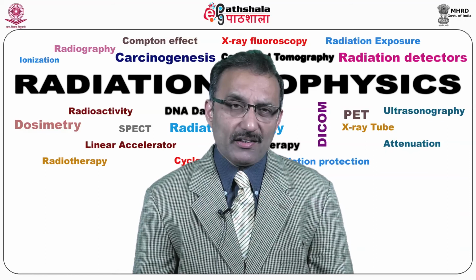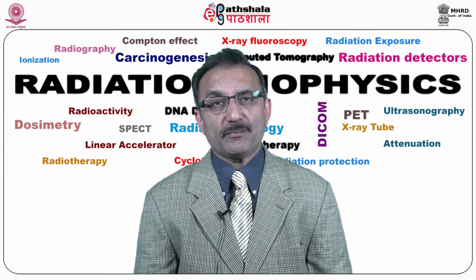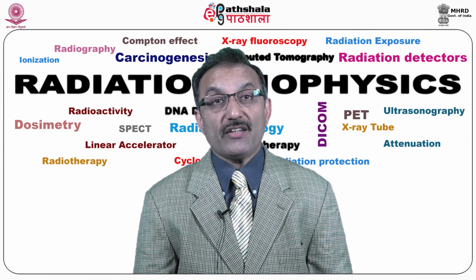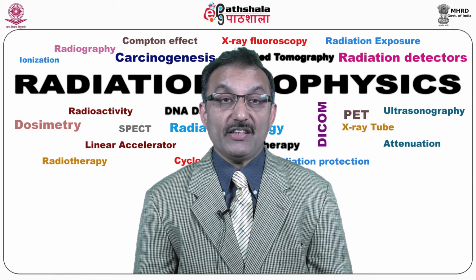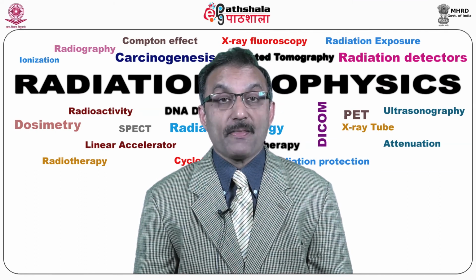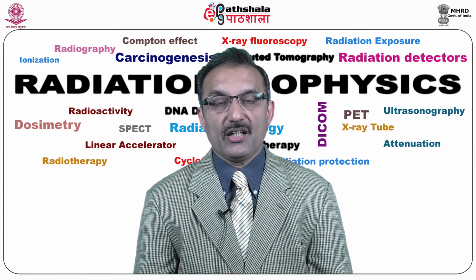Whenever a medical examination takes place, we know there are no limits for medical exposure, but it does not mean you give more activity to the patient to get the scan done. So optimization has to be done in a very systematic manner, so that you get a good quality image by giving less dose, in less time, and with less discomfort.